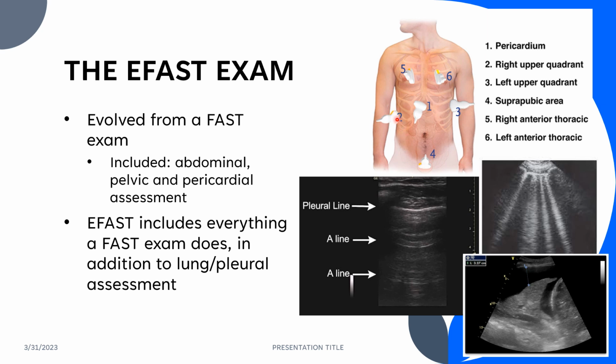Then if you so choose, you can go and look in this paracolic area, but they really do suggest that you next go on to the bladder. You're going to evaluate the bladder in transverse by sweeping all the way out of the bladder to the top, all the way out of the bladder to the bottom, moving it to sagittal or long, and scanning all the way out of the bladder right and left, and looking for any free fluid in this region.